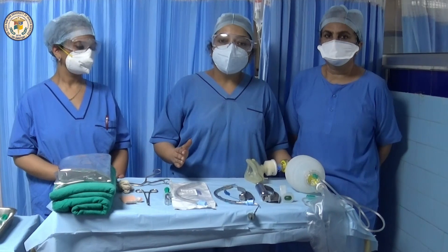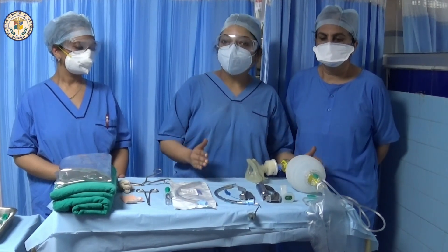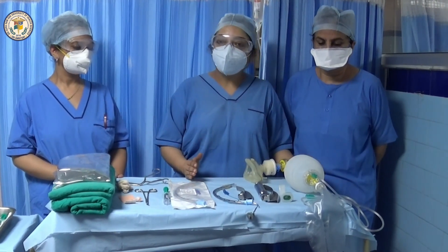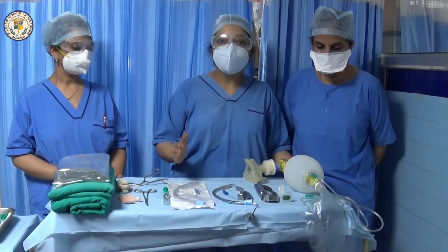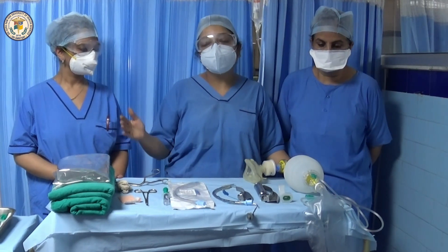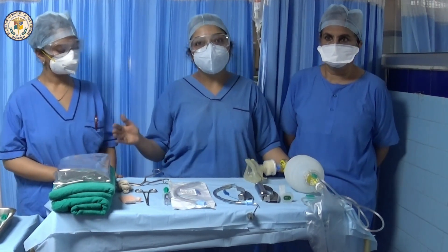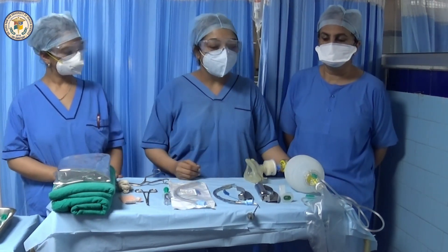Before starting the procedure, check oxygen supply, suction equipment, IV access, and establish heart rate, blood pressure, and SpO2 monitoring.